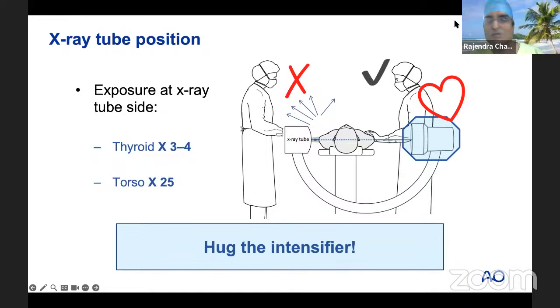Reconfirm. Reconfirm. It looks logical to me, basically, because it's an X-ray tube, the radiation passes. Scattering happens as soon as an X-ray beam strikes the patient and you get scattering. Scattering does not happen after the beam passes through the body. And I suppose this diagram is right, what this slide shows. Okay. I'll get back to you. See, we are not experts in all this. Ultimately, this knowledge is only from you, so we have to understand from the literature and from the images. We'll get back to it again, sir.